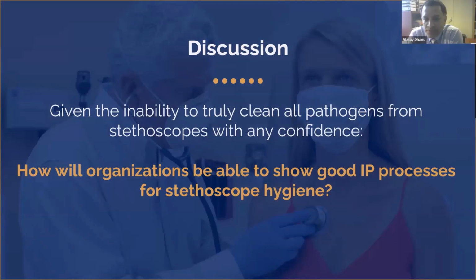I think this highlights the problems. What are the current standards for stethoscope hygiene? The first step would be to actually define what the best practices for stethoscope hygiene are. And I think the limitations of this are pretty clear. Alcohol does not work. Alcohol, on the other hand, can actually create new issues regarding tolerance and increased sporulation of C. diff. The second thing is, how well can you wash the stethoscope? What are the other options? Can you use a disposable stethoscope?